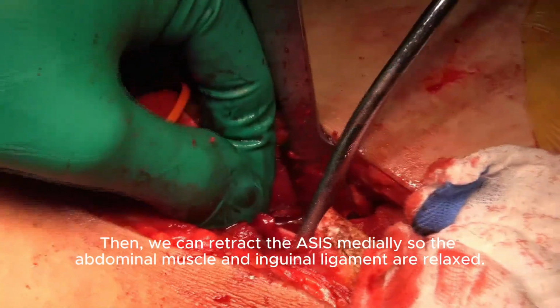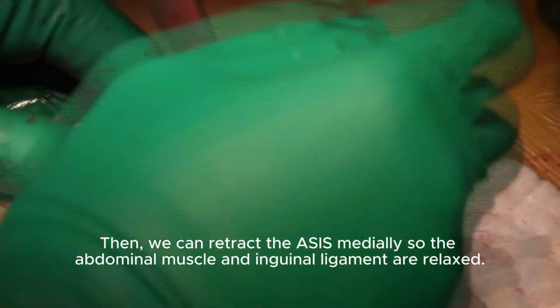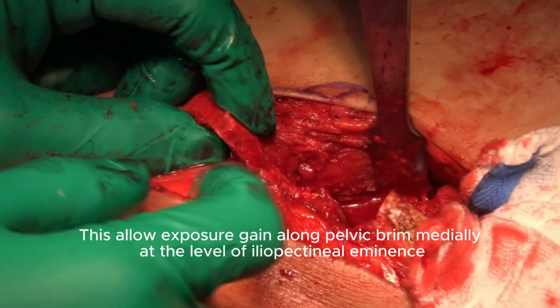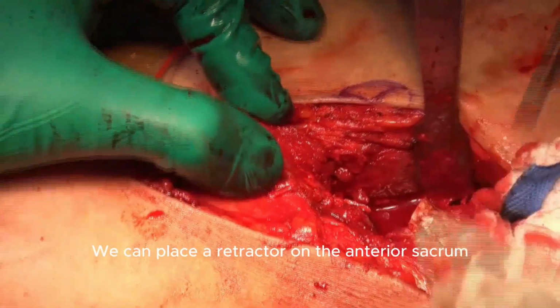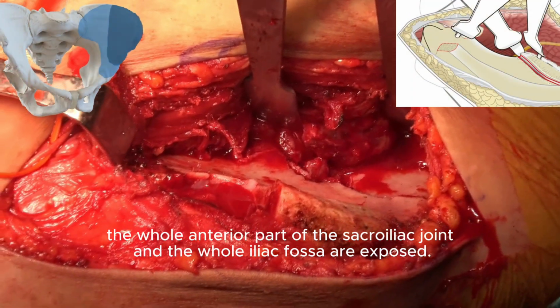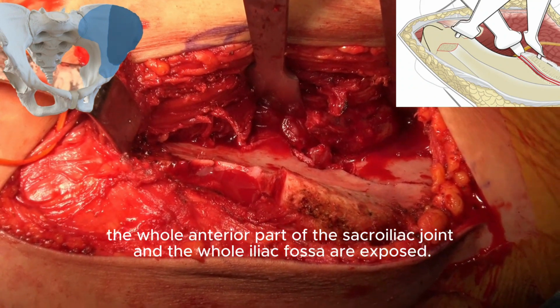Then, we can retract the ASIS medially so the abdominal muscle and inguinal ligament are relaxed. This allows exposure gain along the pelvic brim medially at the level of the iliopectineal eminence. We can place a retractor on the anterior sacrum. The whole anterior part of the sacroiliac joint and the whole iliac fossa are exposed.